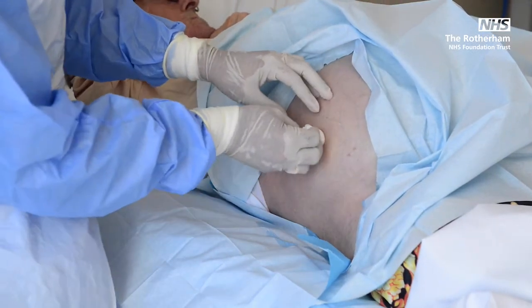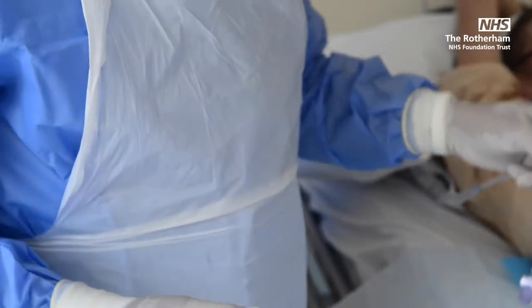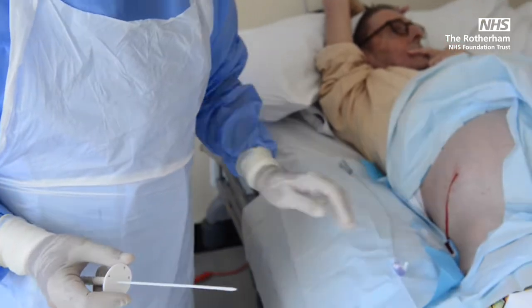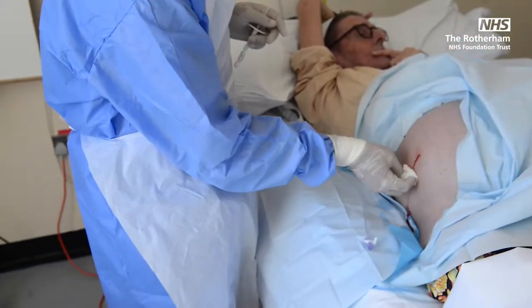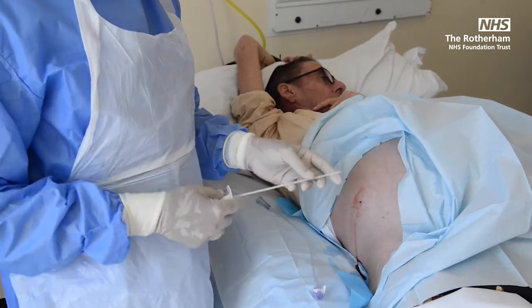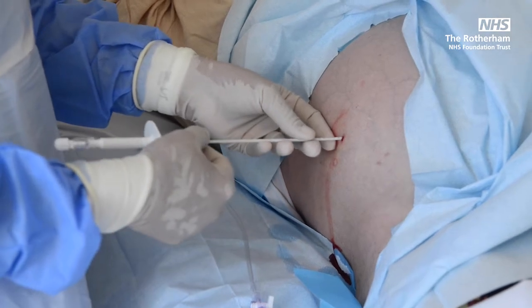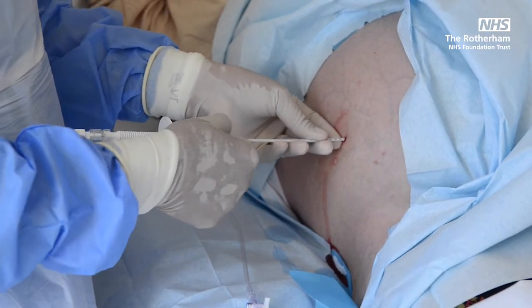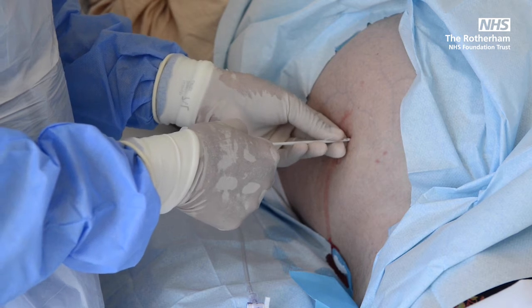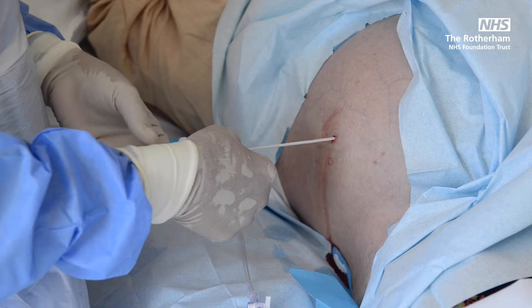Okay. So next we'll take the rocket multipurpose needle and also take the drain and keep that here on your sterile area. Then I'm going to make sure that the bevel is up. I'm going to introduce it straight, perpendicular to the skin, and insert it as soon as you feel the give-in. I've got the give-in.